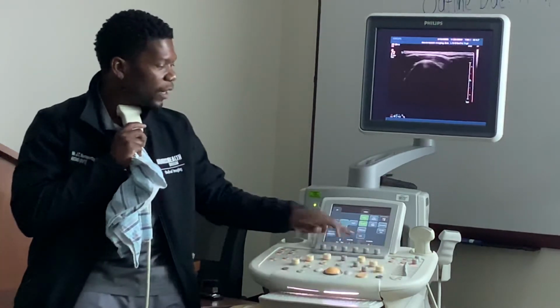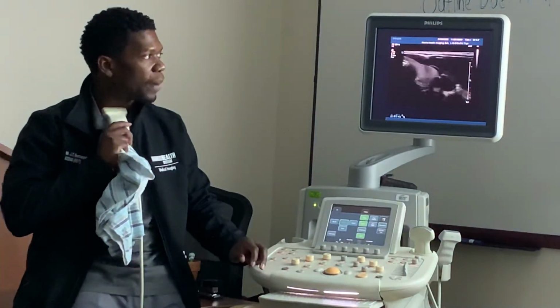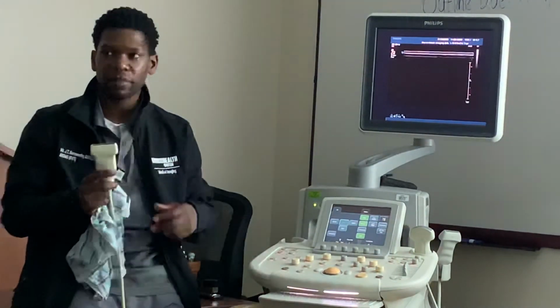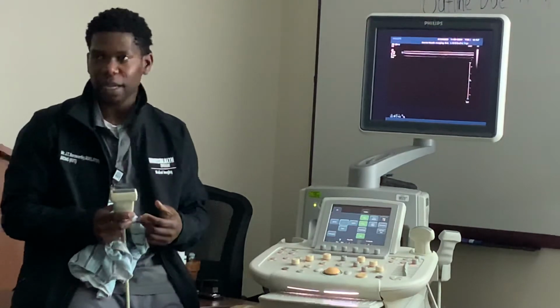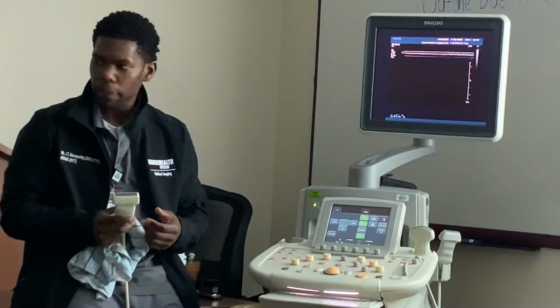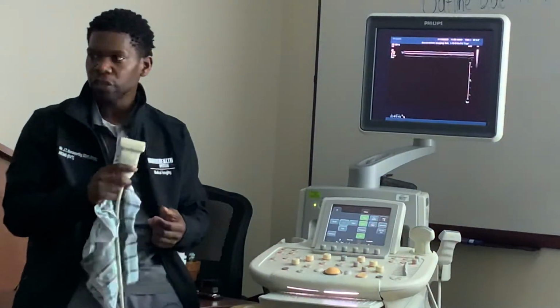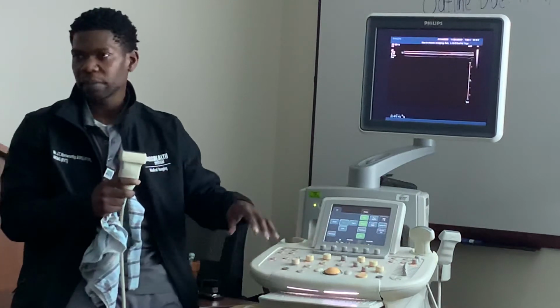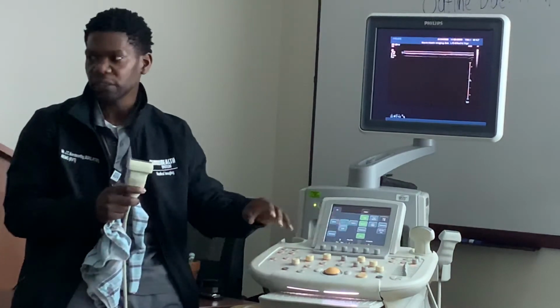With AGC on, it does it automatically no matter what. That's the purpose of it: to amplify, automatic gain compensation. You just turn it on; it's not something you adjust. So as you're moving, you don't have to hit iScan all the time. It's like having iScan on every single time you move the transducer.